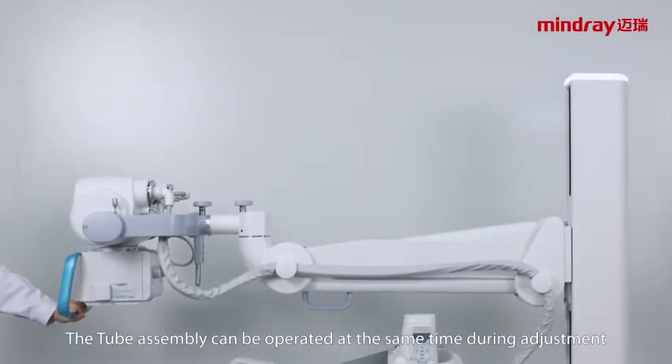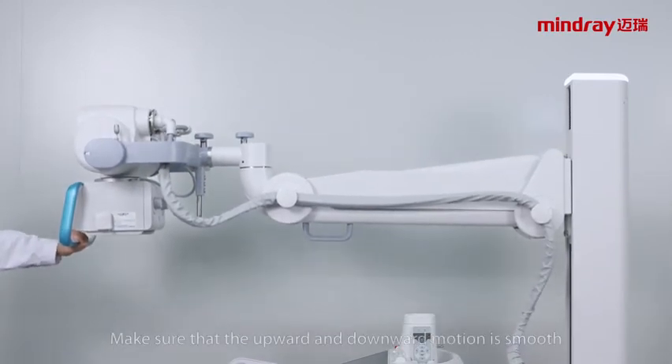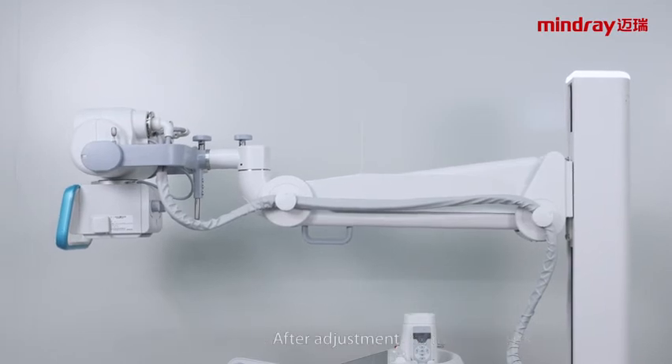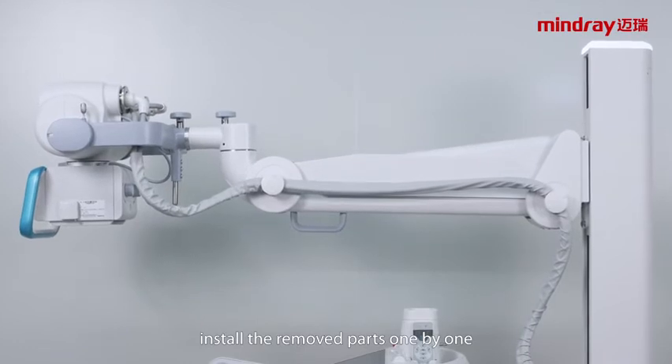The tube assembly can be operated at the same time during adjustment. Make sure that the upward and downward motion is smooth. After adjustment, install the removed parts one by one.